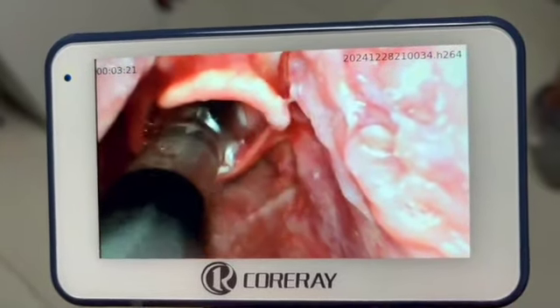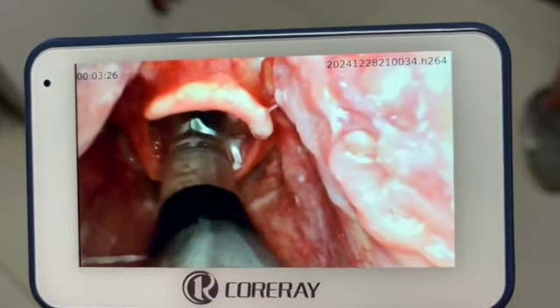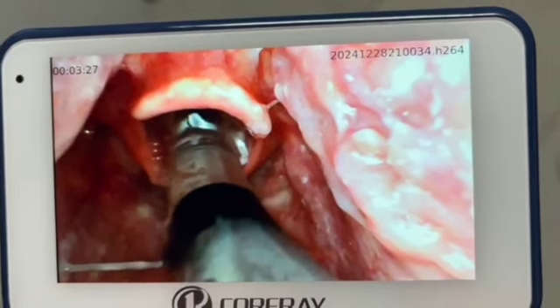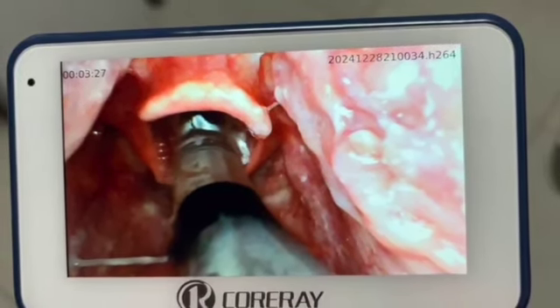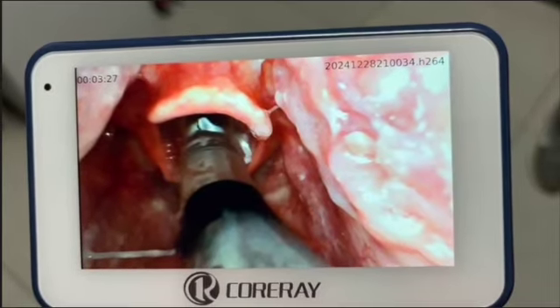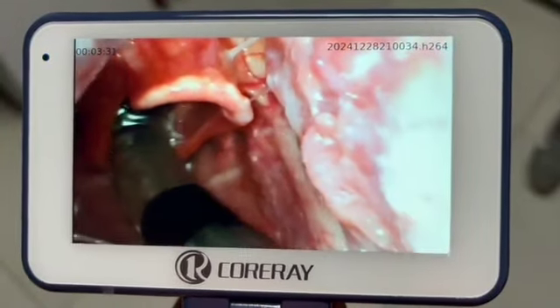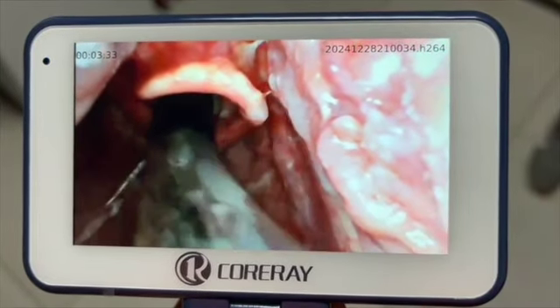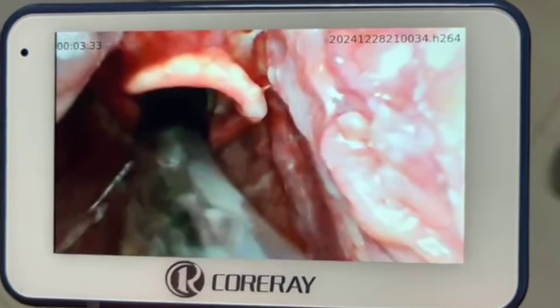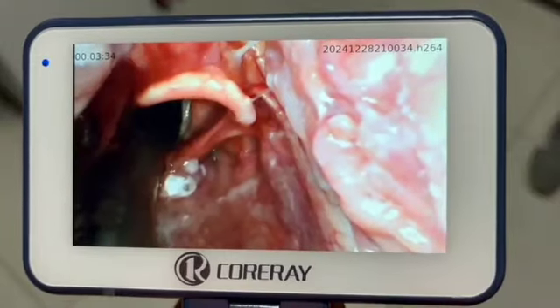once you get it up and into that upper airway. So you can see with the video what ended up happening is that we got the tip of the tube in, and I started pulling out the introducer, but actually pulled the introducer out too fast and then couldn't insert the rest of the tube. And so what then had to happen was I had to reintroduce the introducer as deep as it would allow me, and you can see it sort of happening now. And then I had to use the rigidity of that introducer with it not all the way to the tip, just to allow for that insertion. And that was then followed by removing the introducer and having the patient fully intubated.